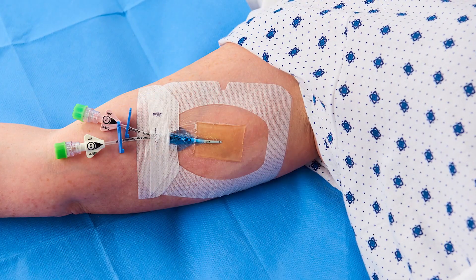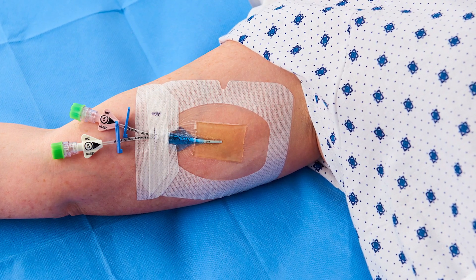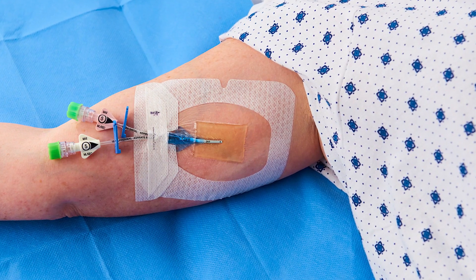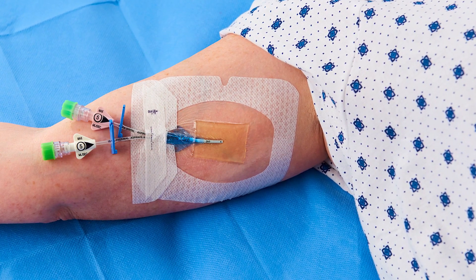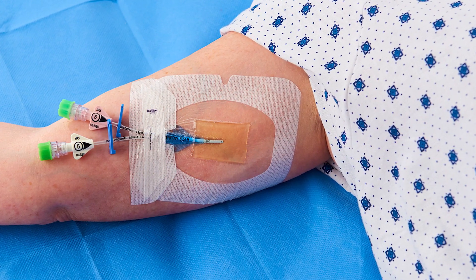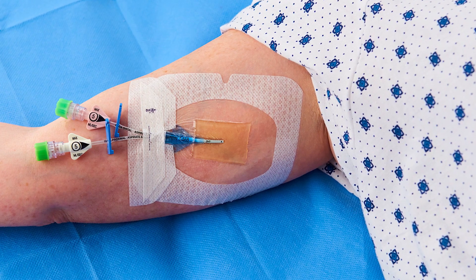The Tegaderm CHG dressing should be changed every seven days, or according to your facility's established protocol, or when the dressing becomes loose or soiled, the gel pad is saturated, or in cases where there is swelling, visible drainage, or lost visibility.